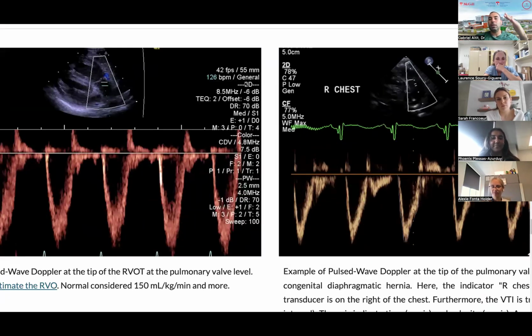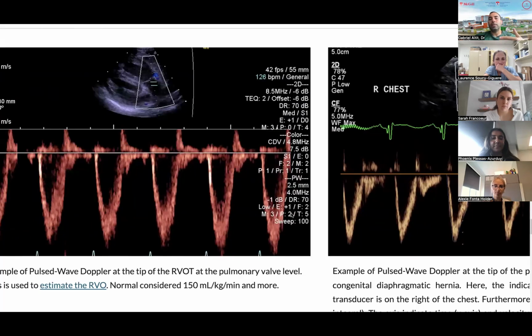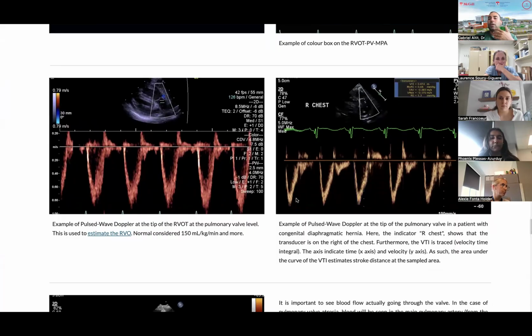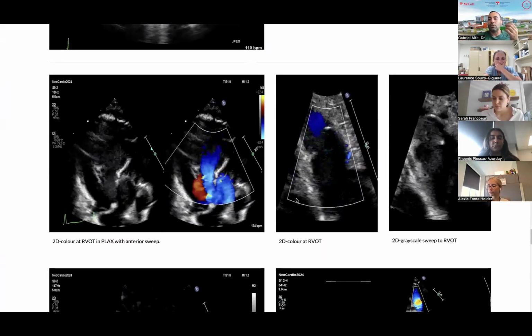This is an example of a Siemens, where instead of being on the left side, it provides you all this information on the right side. You'll often not look at most of this information, but sometimes it becomes important if you want to reproduce certain things in your lab for research, for example, or understand how someone got the information.